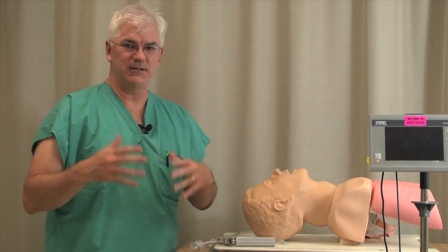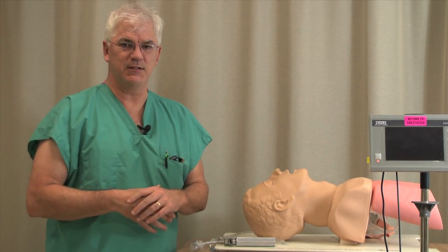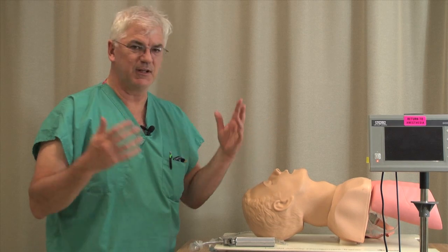Hi, I'm going to talk a little bit about, in this airway management course for the MICU fellows, use of the GlideScope.